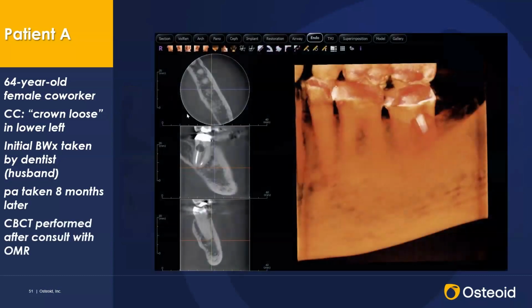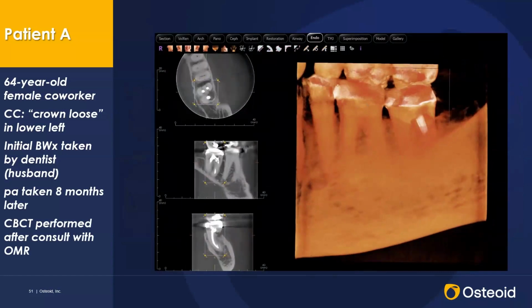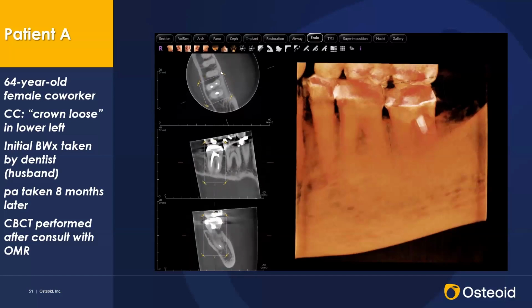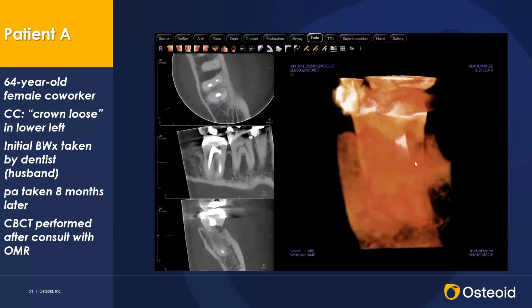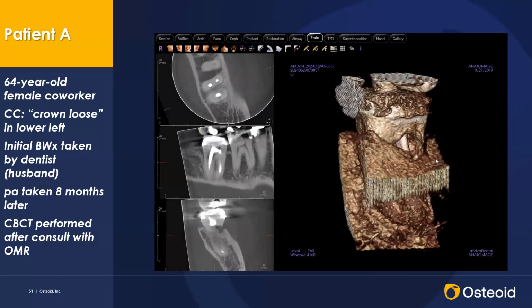18. So again, we're going to go through this particular case using the endo tab mode, and we identify the tooth once again. We change the bounding box. We will then adjust the axes of the bounding box such that it's absolutely perpendicular to the tooth. And then sculpt the three-dimensional image by removing extraneous areas, which may be mesial or distal, or even we can remove a labial, or in this particular case, other areas of bone.